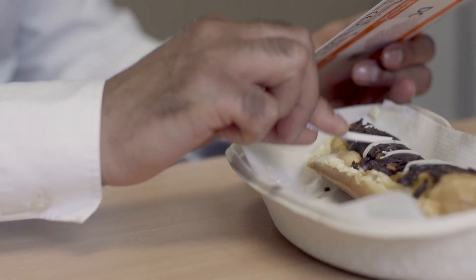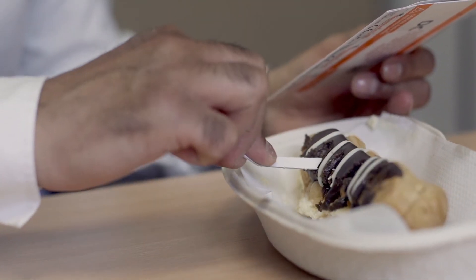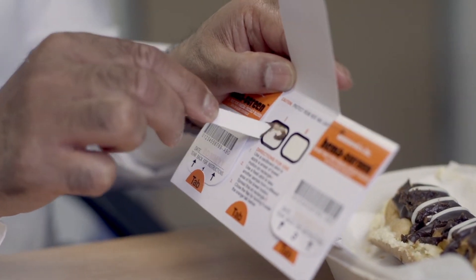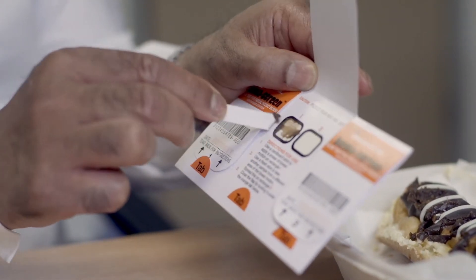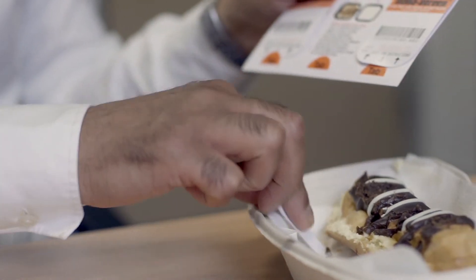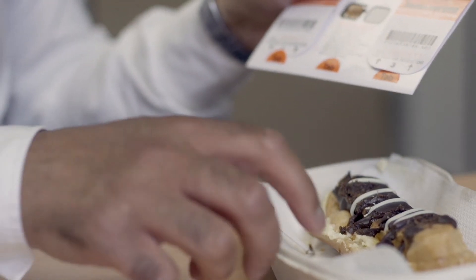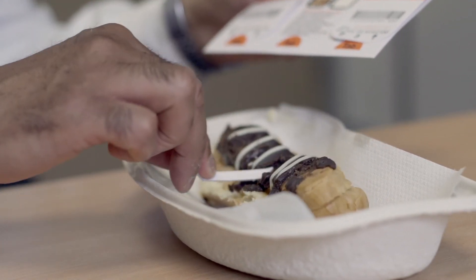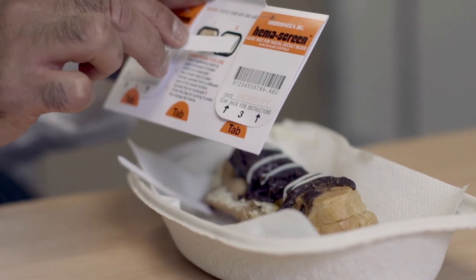I have a sample here. When you're ready, open the tab and break off the first stick. Collect a piece from the side of the sample and lightly smear it onto the first window, and put that stick aside. Now take another fresh stick and do the same again from a different area of the sample, and lightly smear it onto the second window, then put your stick aside and close the tab.